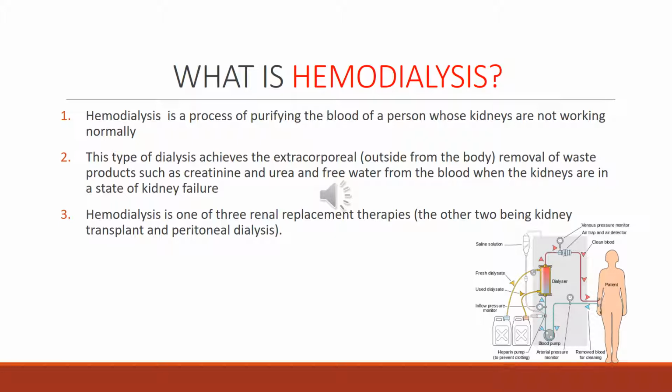Hemodialysis is one of the three renal replacement therapies. An alternative method for extracorporeal separation of blood components such as plasma or cells is apheresis. Hemodialysis can be an outpatient or inpatient therapy. Routine hemodialysis is conducted in a dialysis outpatient facility, either a purpose-built room in a hospital or a dedicated stand-alone clinic.